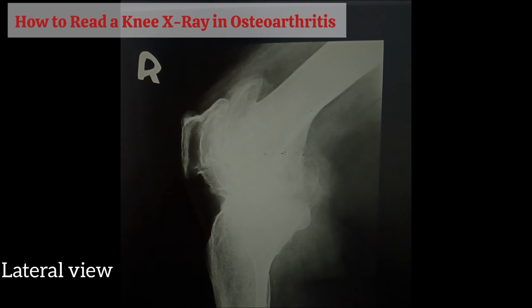Is that clear? So this is for today, guys. Hope you guys understand the basic concept of X-ray interpretation, and we'll make more videos in the future.